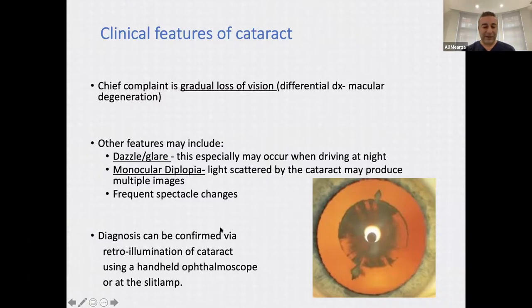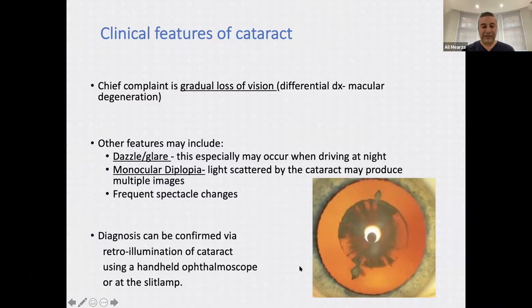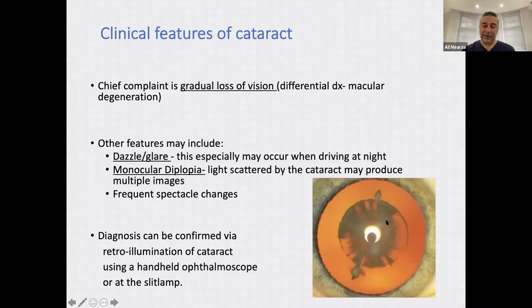As a diagnosis, cataract can be confirmed via retro-illumination using a handheld ophthalmoscope or at the slit lamp. This is an example of what a cataract looks like with retro-illumination against an ophthalmoscope light.